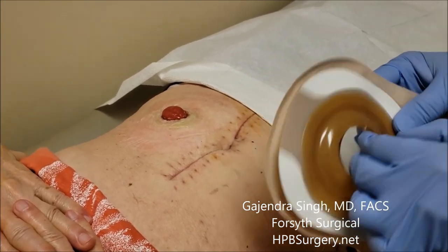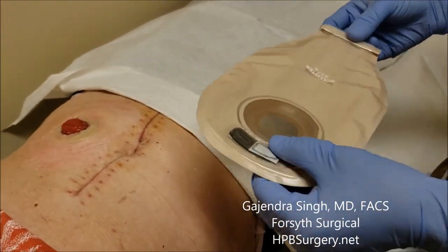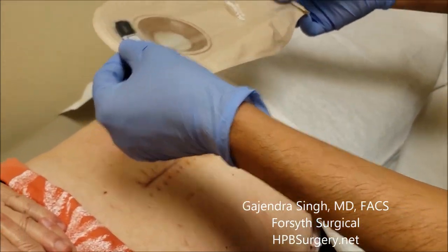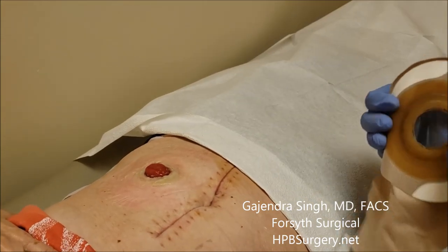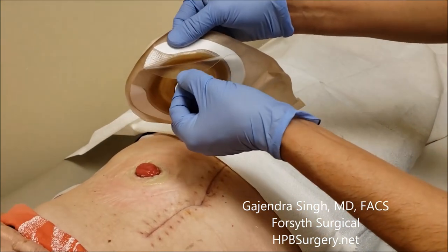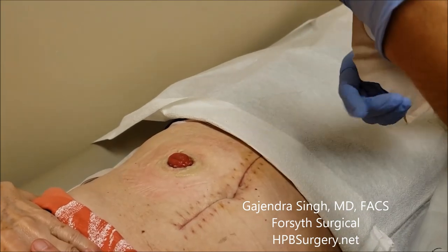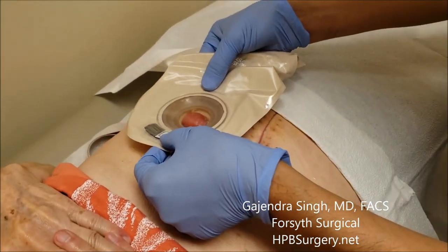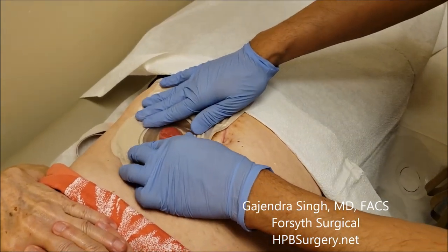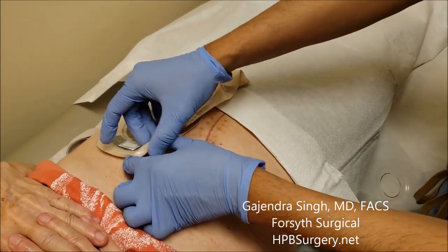Here is the hole cut in the bag. The way you put it on, position the bag so it faces down for standing — that way when stool comes out, it drops into the bag. Don't put it on the side unless the patient is bed-bound. Peel off the backing, place it right on, and apply a little pressure. Then put the sticky paper tape on the side.